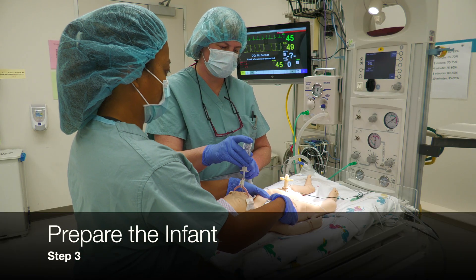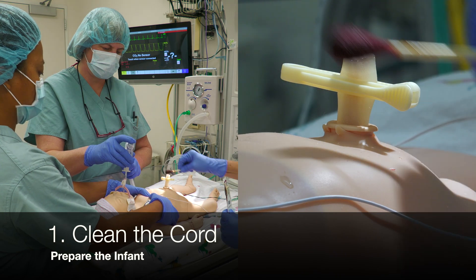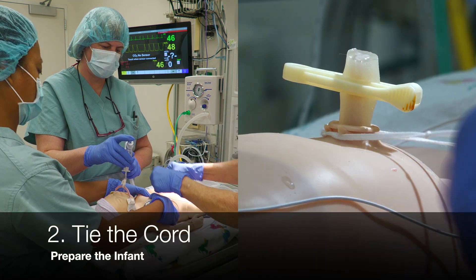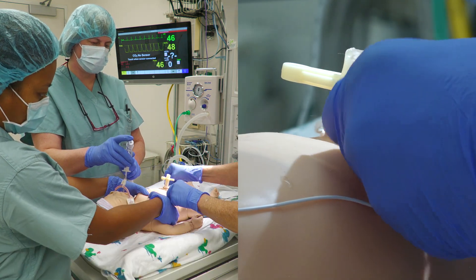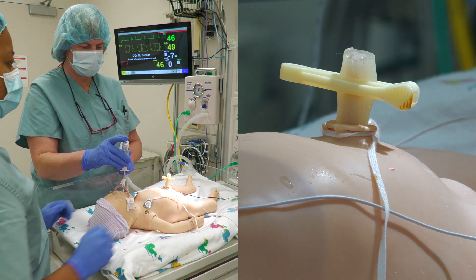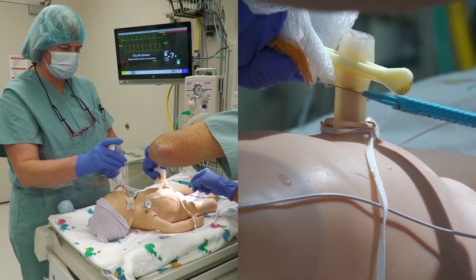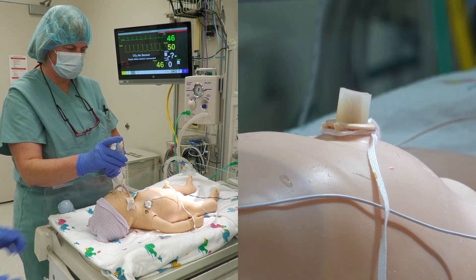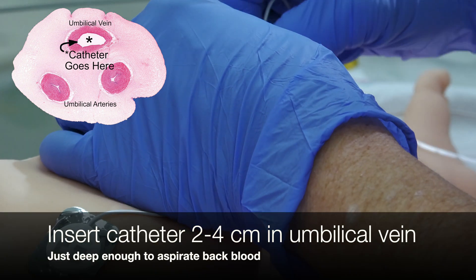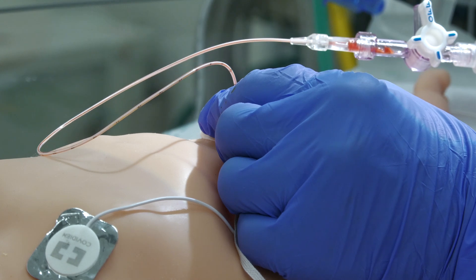You are now ready to prepare the baby and place the catheter. There are three steps to prepare the baby. One, clean the cord with betadine or other antiseptic. Two, tie the cord with the umbilical tie. Briefly pause compressions and caution the team that a scalpel is entering the field. Then three, cut the umbilical cord with a scalpel below the umbilical cord clamp to about 1-2 centimeters above the skin. The umbilical vein is the larger thin-walled structure. Insert the catheter in this vein 2-4 centimeters while gently aspirating back until you get free flow of blood.